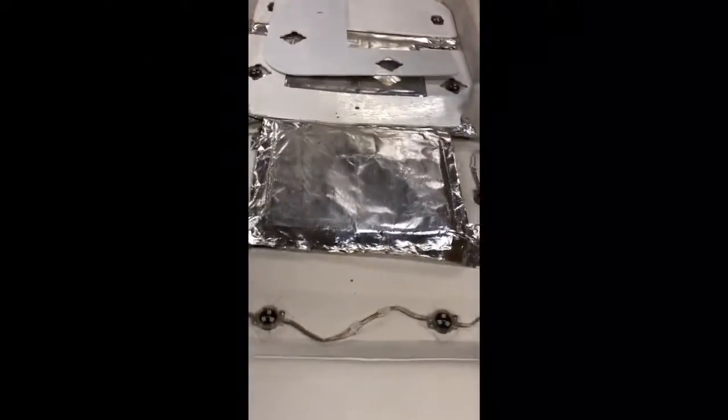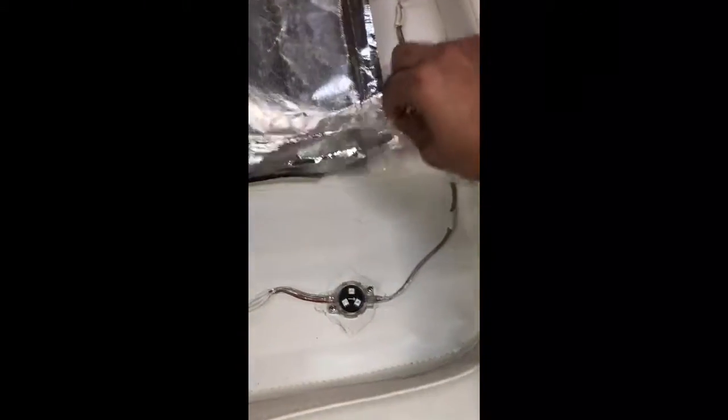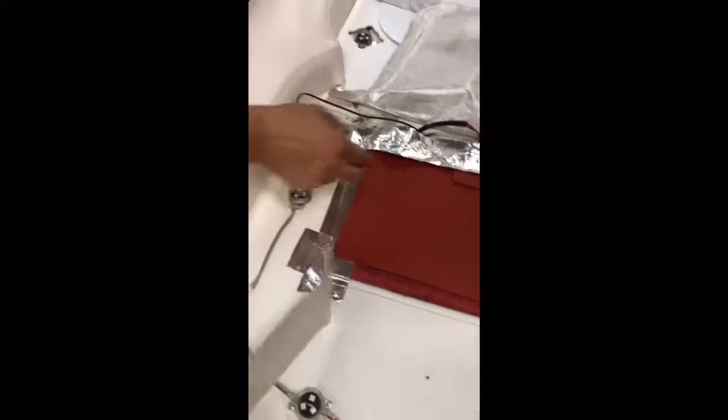Once the cover is removed, you're gonna gently go ahead and remove these tapes, like this. And once those tapes are removed, what we're gonna do is trace this cable, the red cable that goes inside of the black tape.